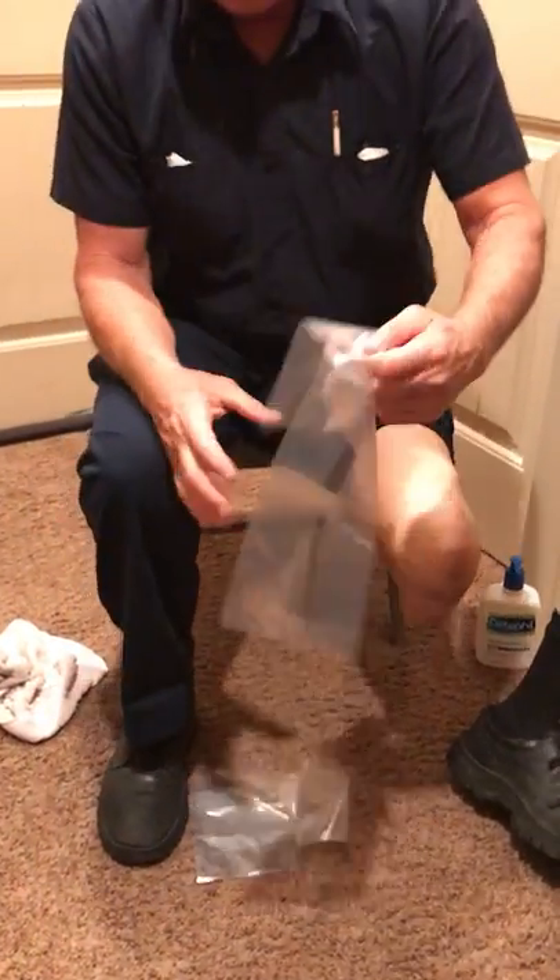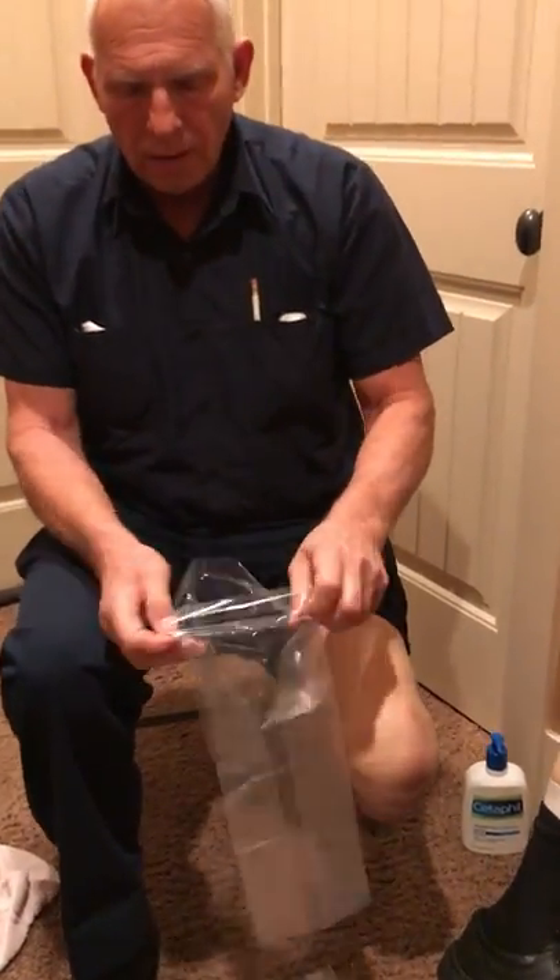In the mornings when I get up, I'll take a shower and put my leg back on. I'll show you what I do when I put my leg back on. So I've taken a shower and I'm out of the shower. I grab my plastic bags. Don't blow in them to open the bag up — just take the bag and slide it over your stump.